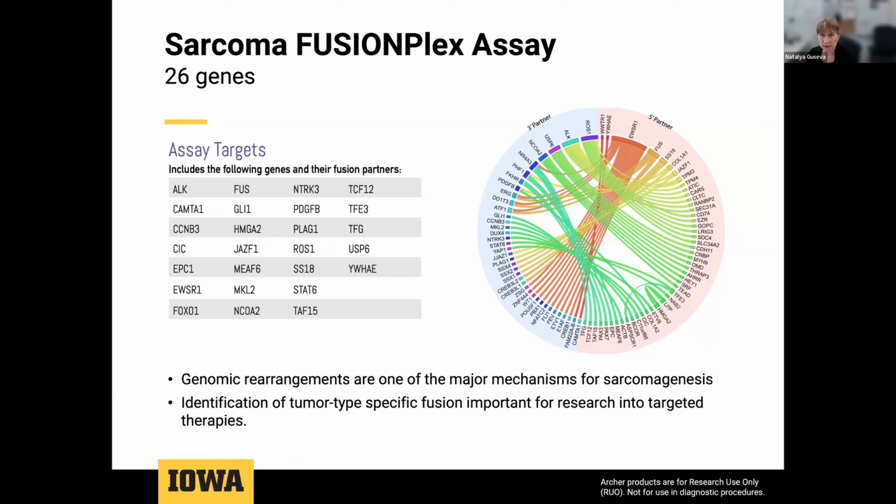And it was apparent that this assay can be used to identify all of the genes listed on this diagram. The targeted genes here in red could be detected, but also all possible partners with these targeted genes, and some unknown partners not previously reported could also be detected. This was very appealing to us.